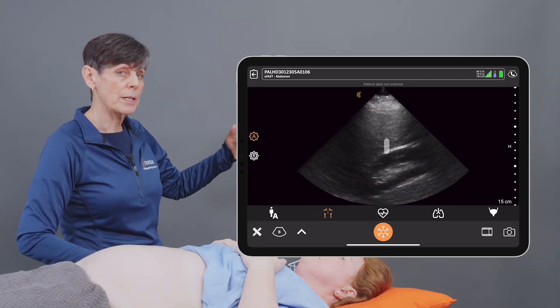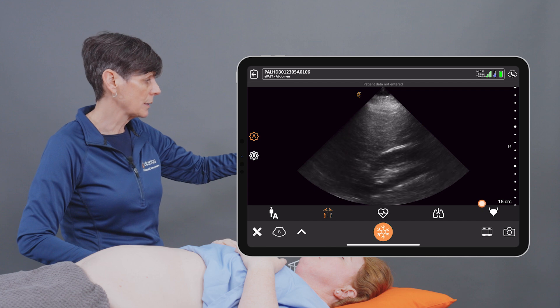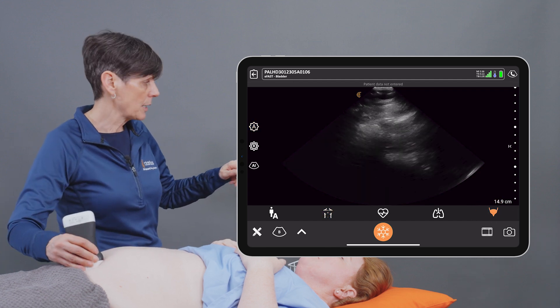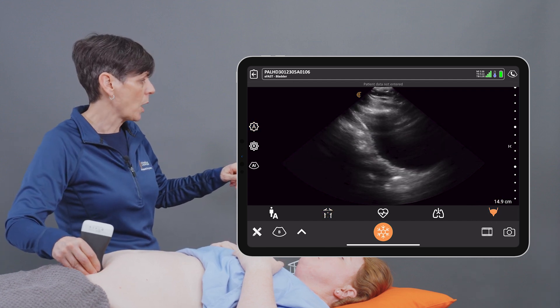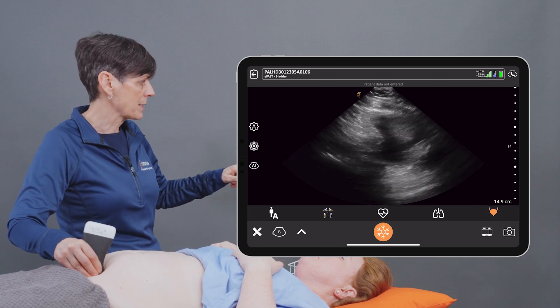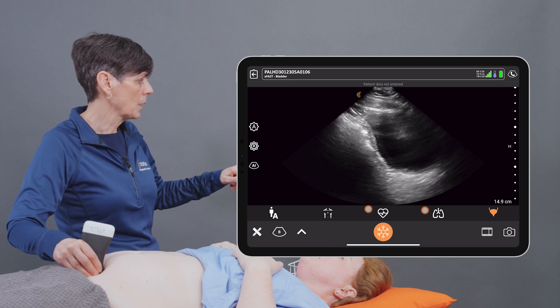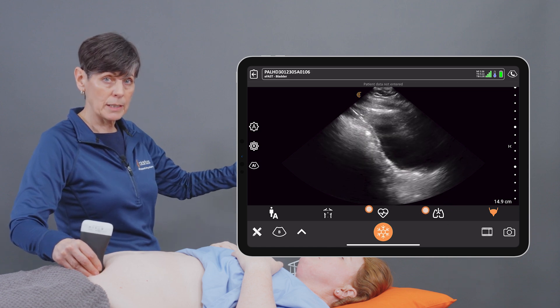When I want to switch to bladder, I simply select the bladder icon. We'll go down to the bladder and the image will be optimized for bladder scanning. We can do the same for cardiac and lung imaging.